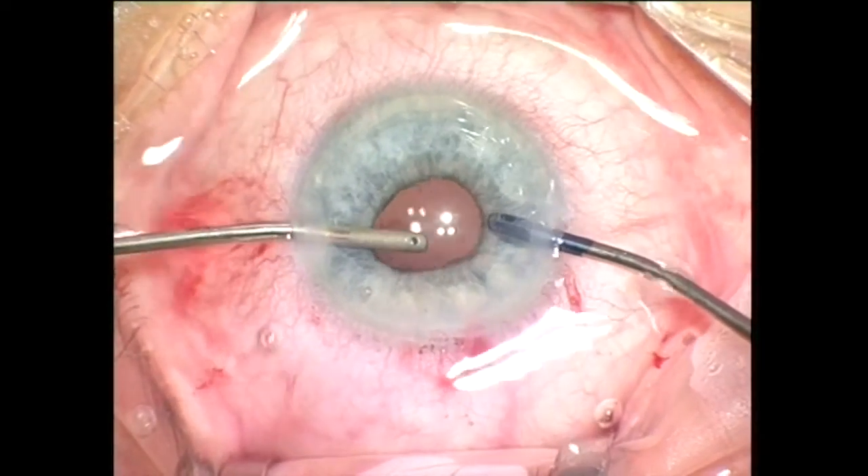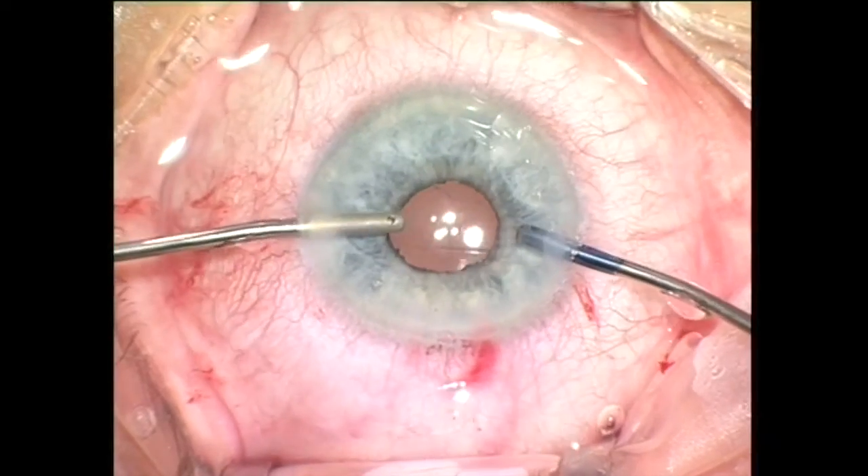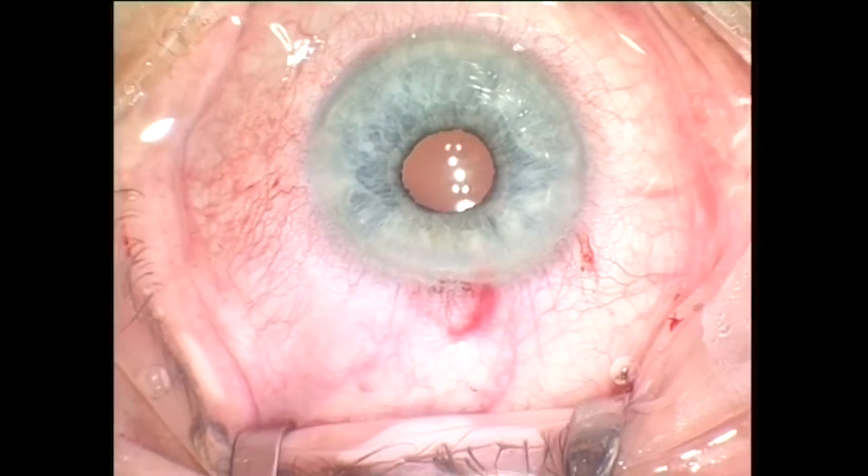Viscoelastic is removed and the pupil constricts spontaneously, and this is basically the end of this case. Thank you for your attention.